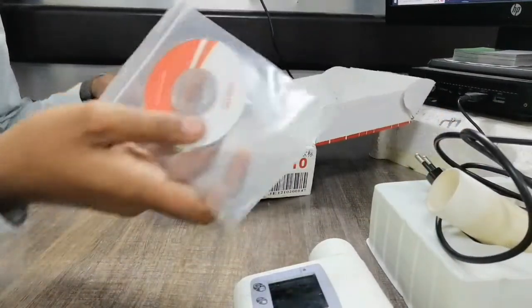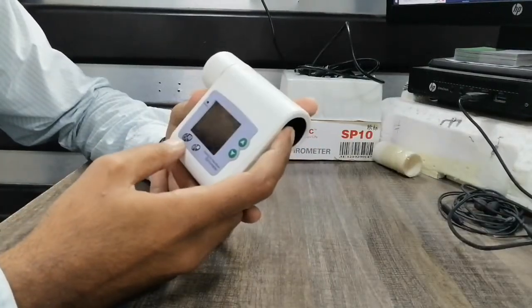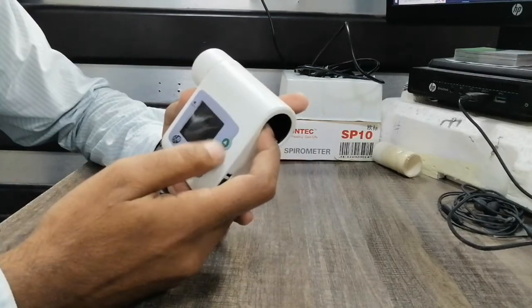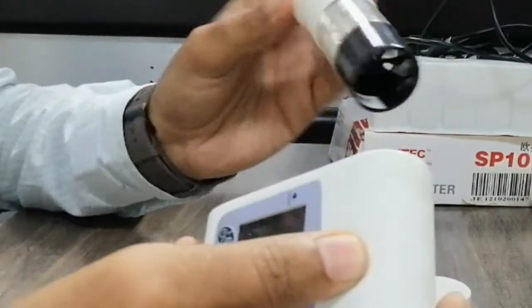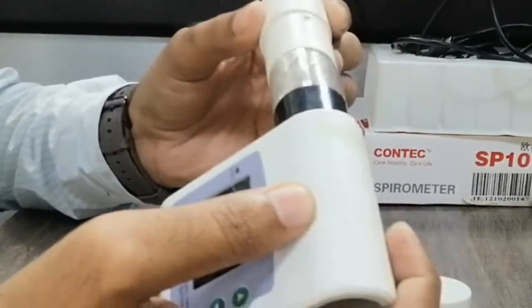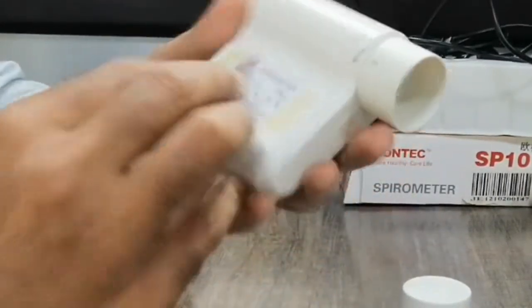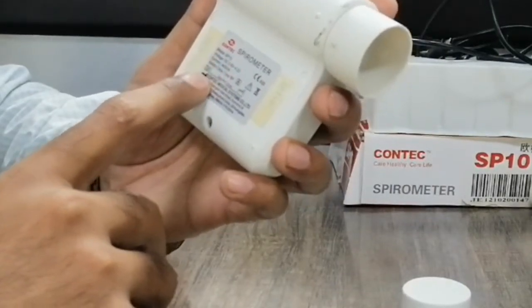Here is the manual book. On the main unit, here is the charging indicator, power on/off button, and menu button. There is also a selection button and up/down menu keys. On the upper side here is the turbine unit, which can be used with the mouthpiece. Here is the lock key, and all the specifications and company model details of this spirometer are listed here.